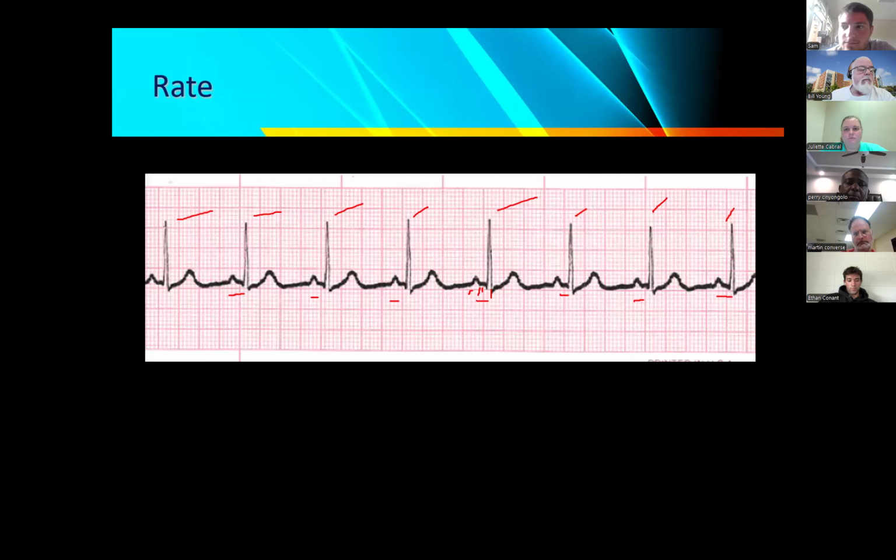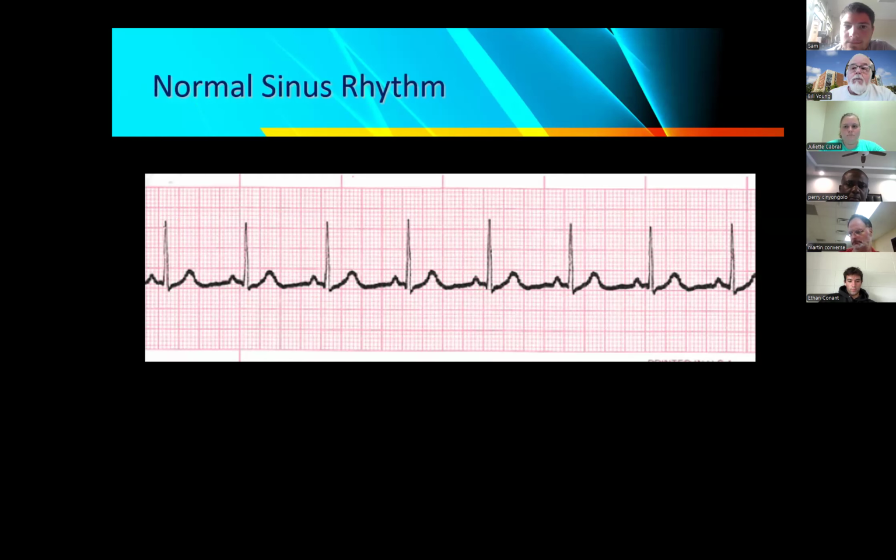So, Sam, name that tune. What is that EKG? Normal sinus rhythm. Yes, you're exactly right. I don't know why I don't have the. Oh, you know what? I know why. Because this was a demonstration one. There you go. It's normal sinus rhythm.